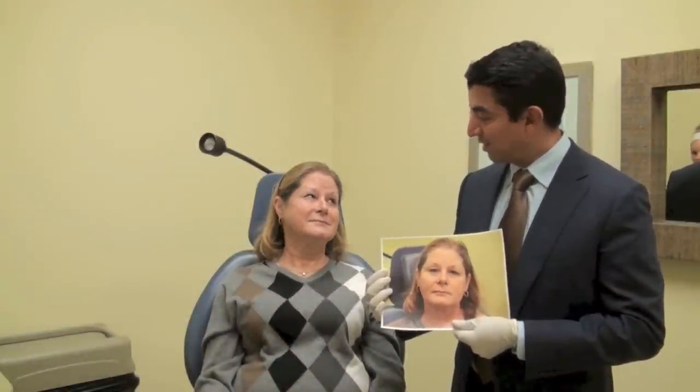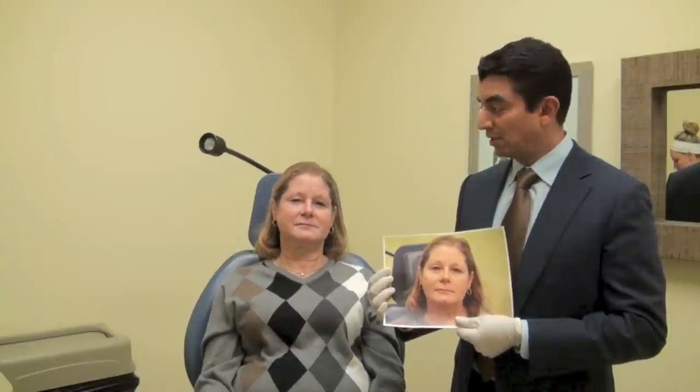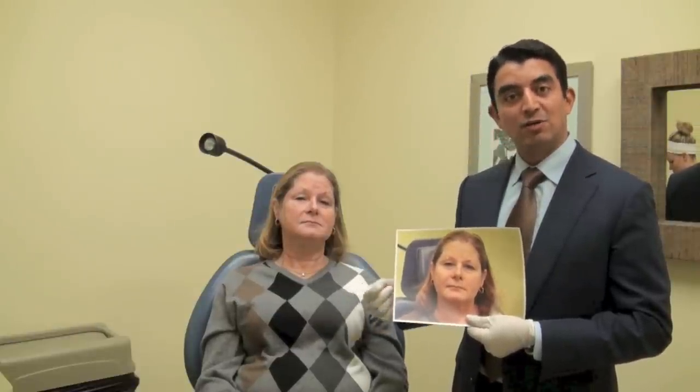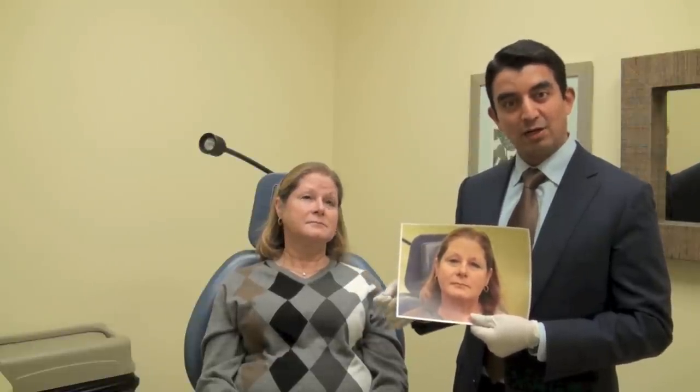We're here with Sandra, our latest under eye filler patient. Sandra is special because we're using Restylane Silk on her. Restylane Silk is a brand new product — the next generation of Restylane — with smaller particle size, finer texture, should swell less, should need less molding. Best for lips, under eyes, and real delicate areas.